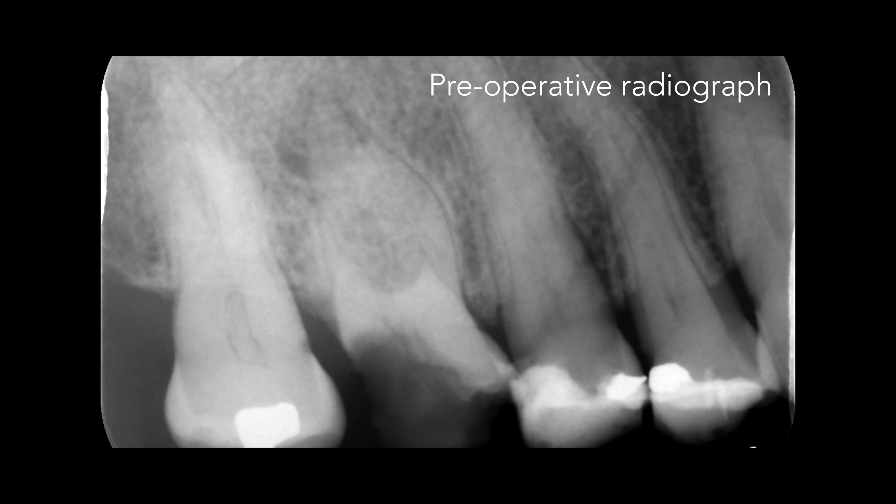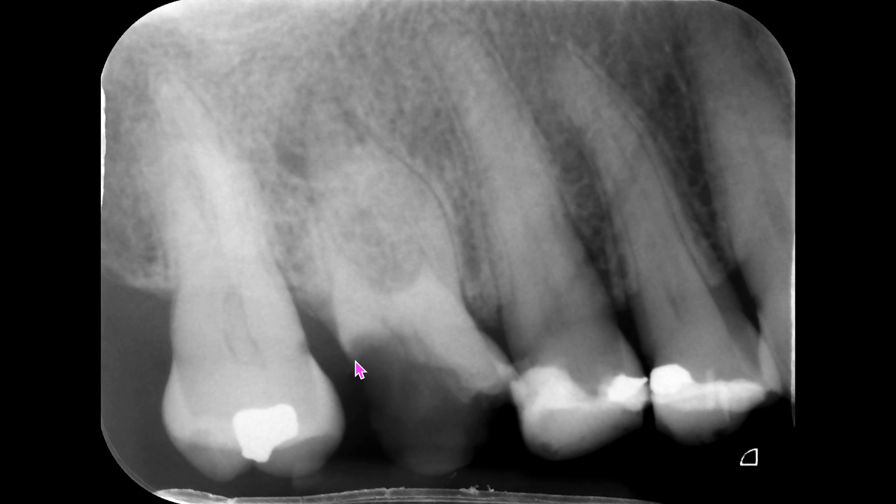Here you can see the pre-operative radiograph of the maxillary right first molar. The tooth is carious and there's a periapical radiolucency. The first assessment that we have to make is a restorative one — there's no point carrying out root canal treatment if the tooth cannot be restored. The root canals appear sclerosed on the radiograph and moderately curved, but don't forget that some of the more acute curvatures occur in the plane that is not visible on the radiograph.